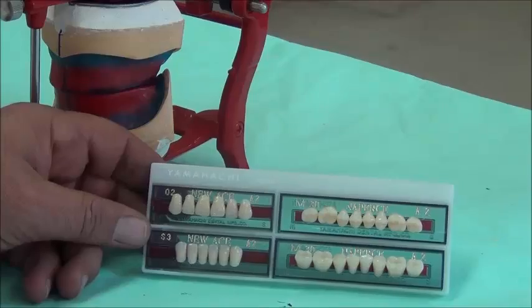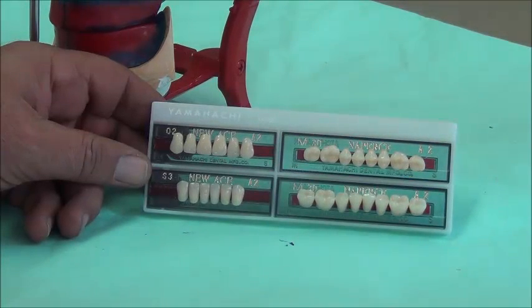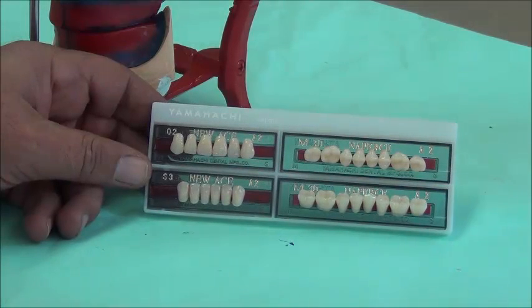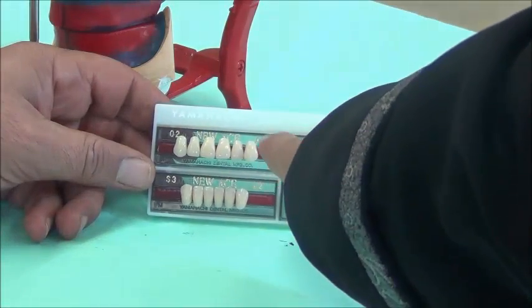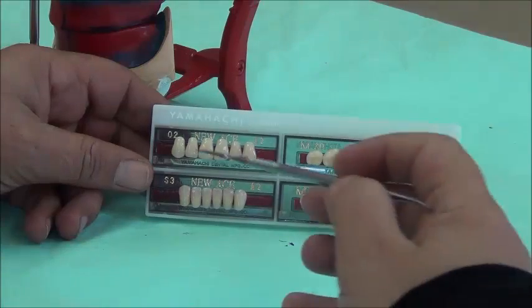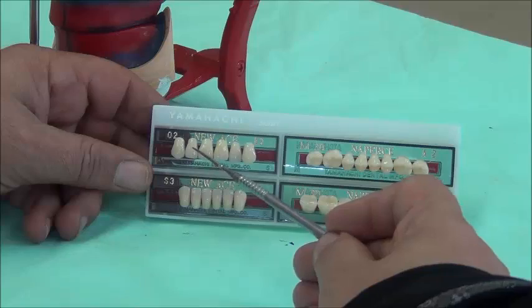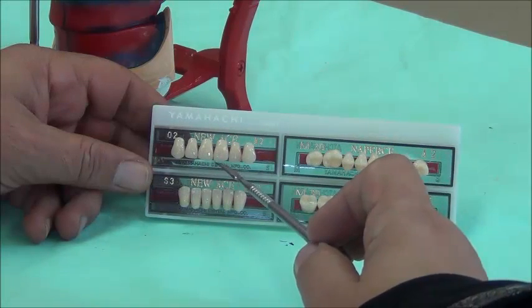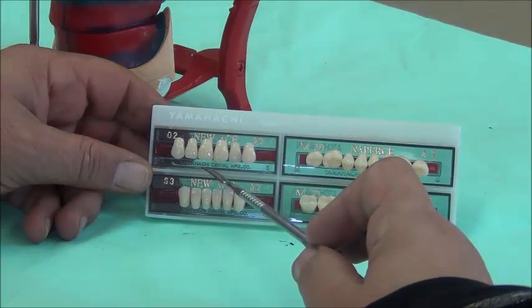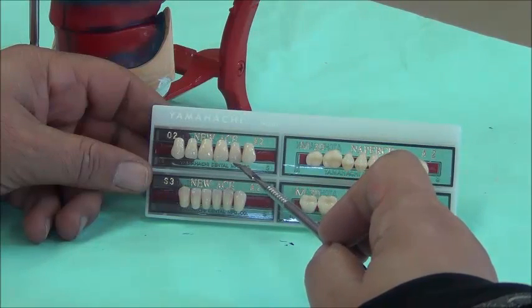The teeth we are using today are made of acrylic, similar to the heat-cure acrylic used in dentures, but manufactured under heavy pressure and high temperature, giving them more cross-linking than the denture base material. They come in sets with numbers corresponding to different forms and shapes. When setting teeth, make sure you identify which is the mesial side and which is the distal side, so as not to mix up teeth while setting — for example, putting laterals instead of each other.